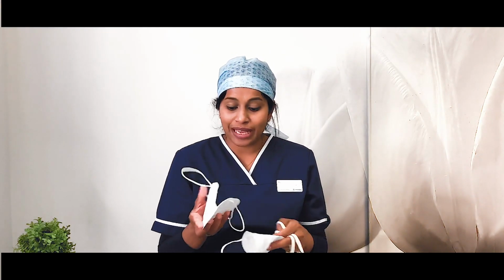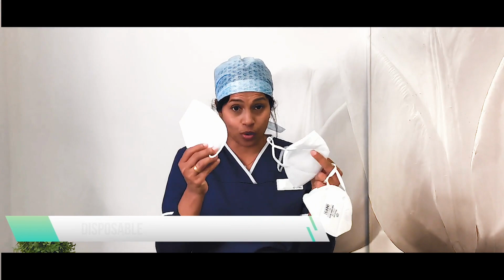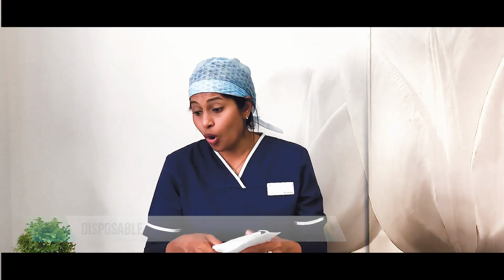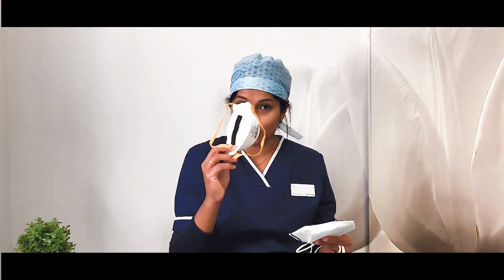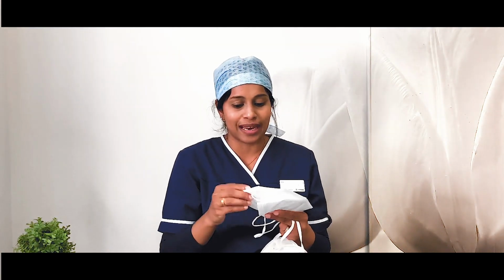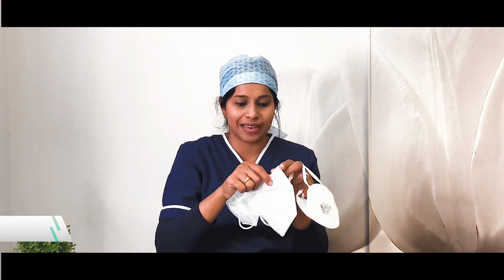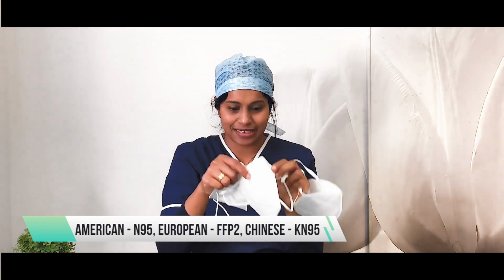So I'm just going to take you through a few of the N95s I could get my hands on. They come either as folded disposable ones, like this, or they come as cup shaped like this. Now the folded ones, you can have them wired outside like this, or the wire is inside like this.